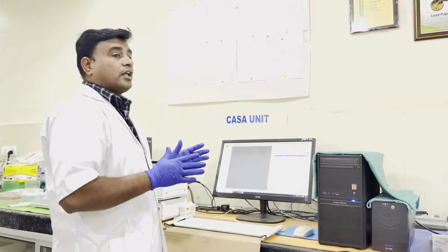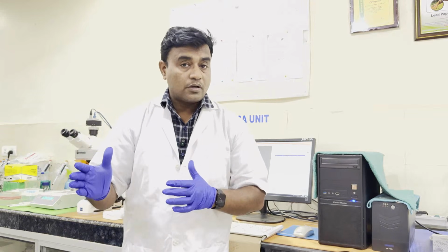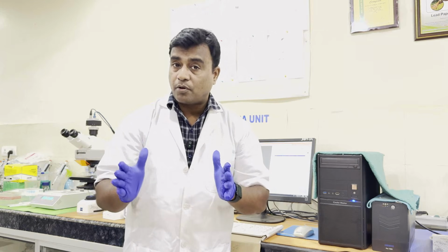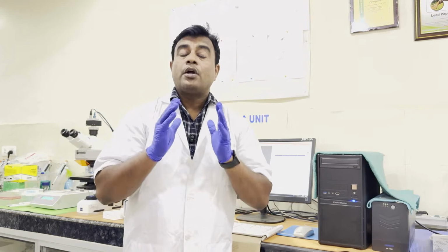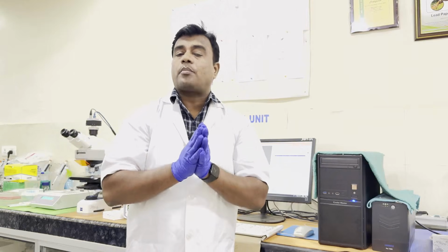Besides this, nowadays CASA are well configured with parameters other than motility and concentration. They can also measure how many spermatozoa are hyperactive and the cervical mucus penetration capacity of the spermatozoa. CASA are also nowadays equipped with new software for the study of DNA fragmentation, acrosomal integrity, mitochondrial transmembrane potential, live and dead count, and combinations of all these.